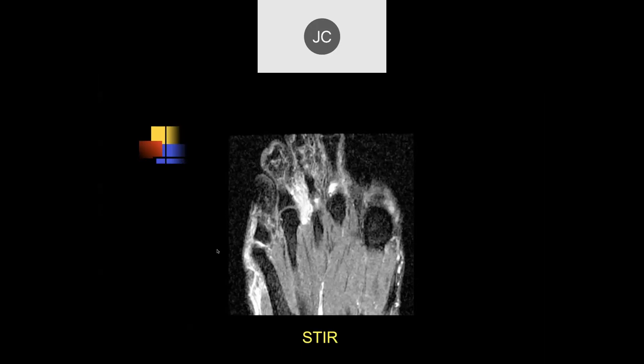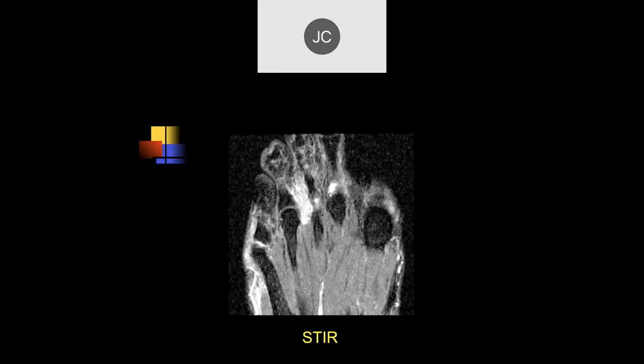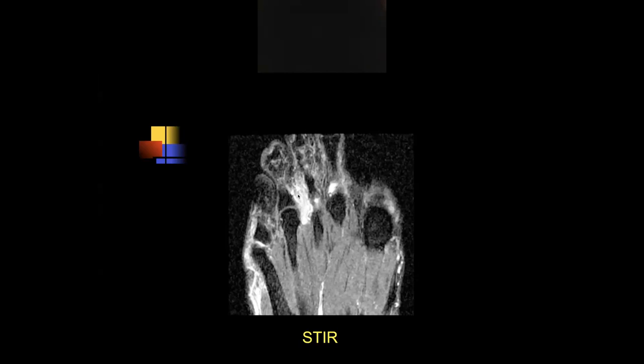Yes, so we have, again, a T2 image. This is a STIR image. The patient has pain and tenderness between the toes. And so we have edema involving the third and the fourth metatarsophalangeal joints.